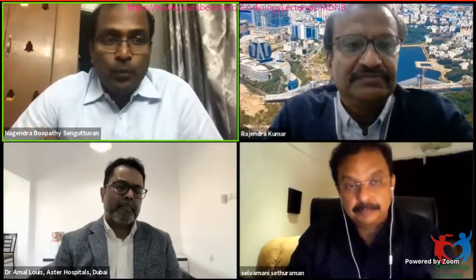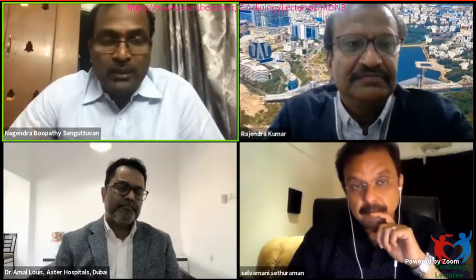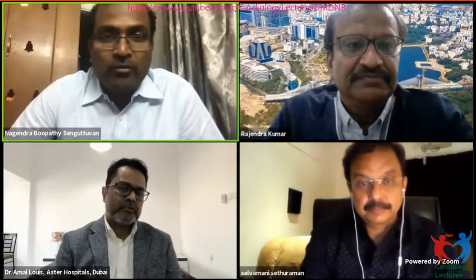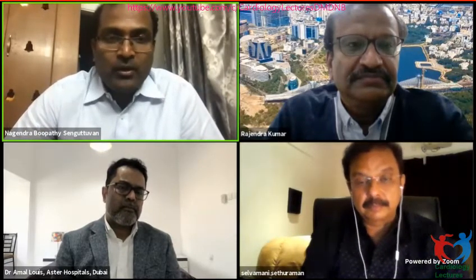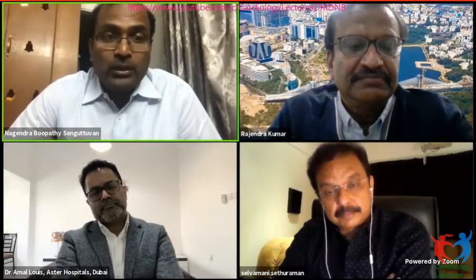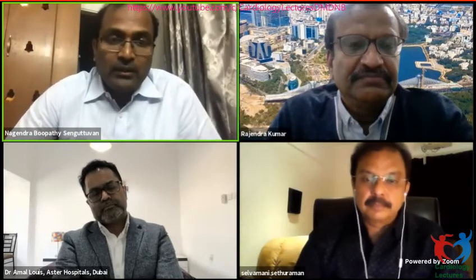Theory wise they give 2.5. Theory wise CP gives 4, but I've never seen CP giving 4. It goes to a maximum of 3.5. With the boost, it can go to 3.7 or so. The 2.5 goes through 13 French. CP goes through 14 French.